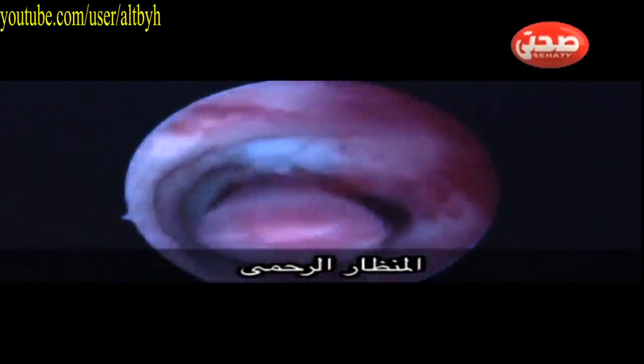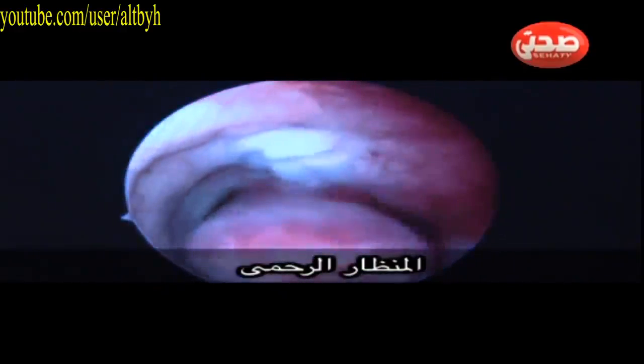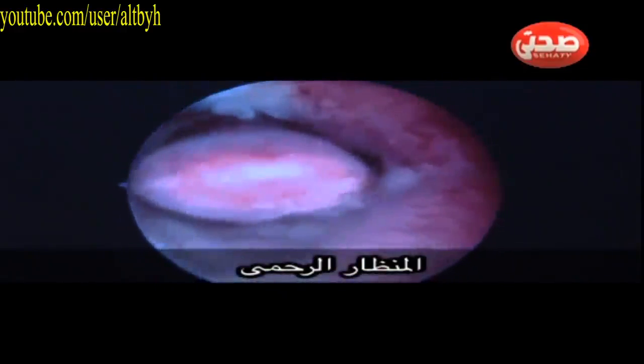This is another view of a polyp in the cavity, again in the lower part, and you can easily remove it by resectoscope or polypectomy.